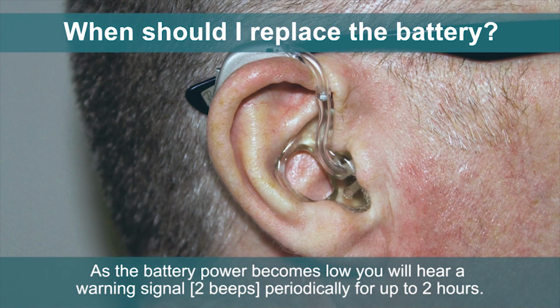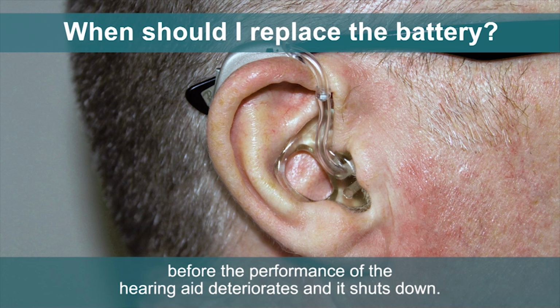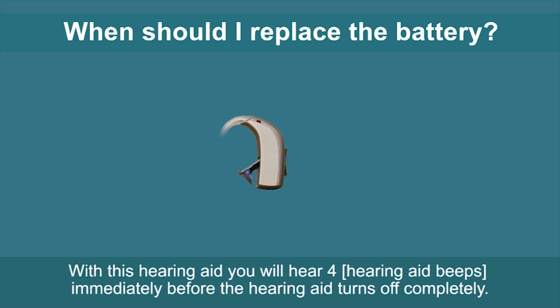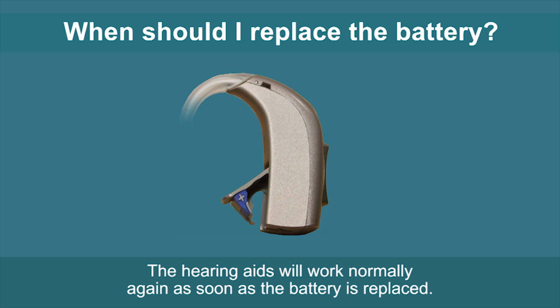As the battery power becomes low, you will hear a warning signal of 2 beeps periodically for up to 2 hours. This indicates that you need to change the battery as soon as you can, before the performance of the hearing aid deteriorates and it shuts down. With this hearing aid, you will hear 4 beeps immediately before the hearing aid turns off completely. The hearing aids will work normally again as soon as the battery is replaced.